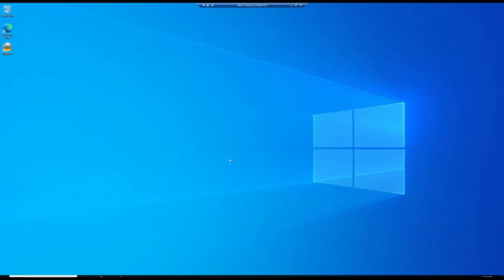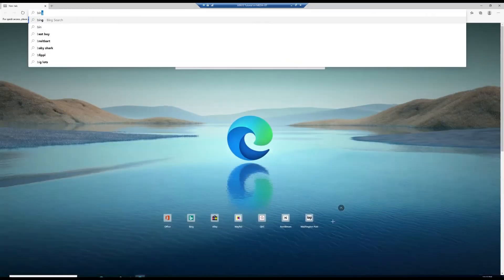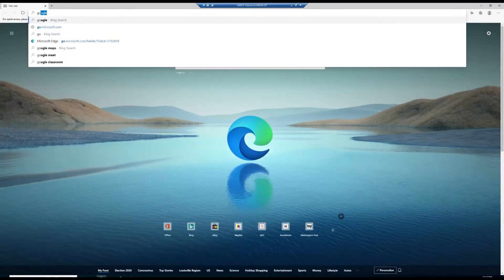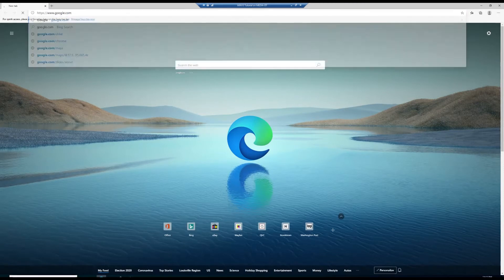Welcome everybody, today we're going to be using MicroDICOM to view radiology images from a DICOM disk or a DICOM ISO. To get started, first we're going to need to open up our web browser and download MicroDICOM. Just do a Google search for MicroDICOM.